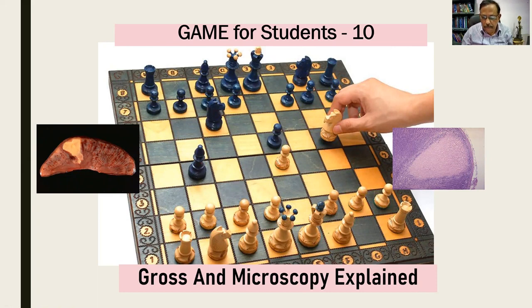And we shall continue playing the game. Gross and microscopy explained.